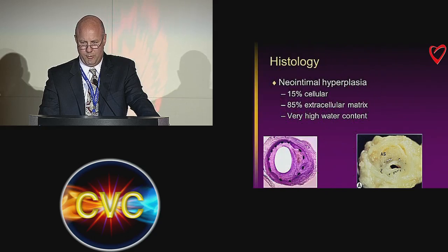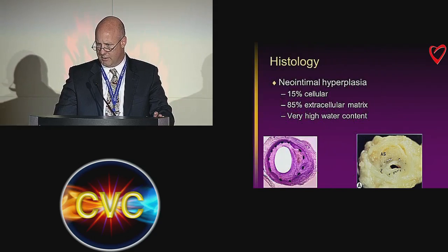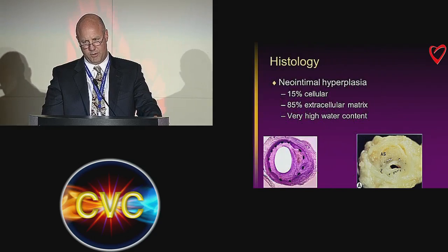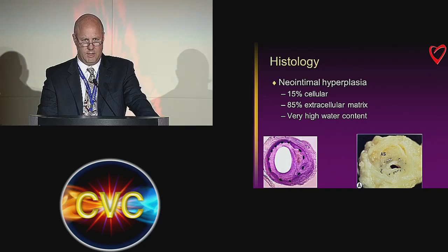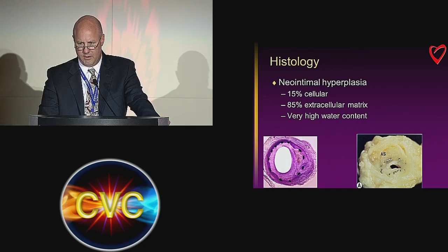Again, we've talked about this background, but I think this puts it into context: the histology, if you look at this, is pretty simple. It's a low cellular environment that has very high water content and very high extracellular matrix content. And when you dilate this with a balloon, you're simply squeezing the water out of this.